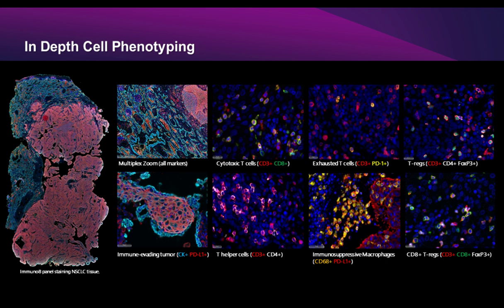Is there a trial and error required to eliminate background? From our optimization perspective, not really. We optimize a primary antibody first, and then we just need to optimize the appropriate amount of imaging strands. But that's pretty turnkey at this point for the amount of development we've done on the numerous markers that we have.